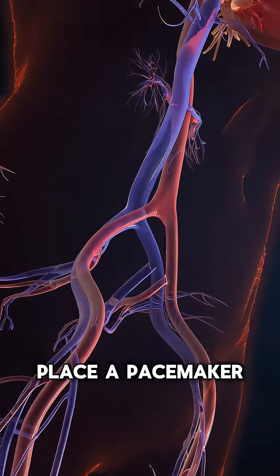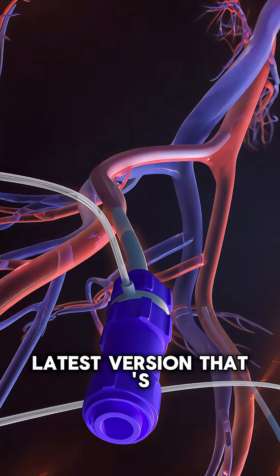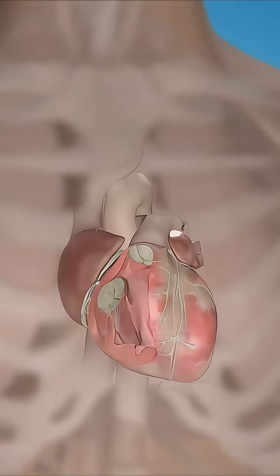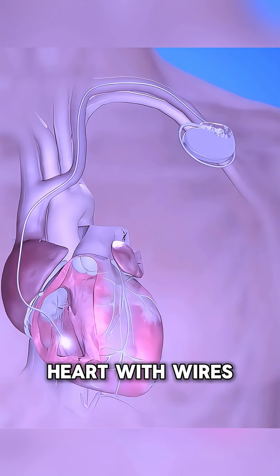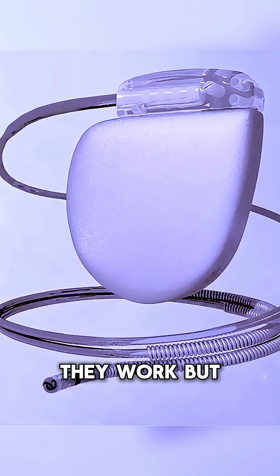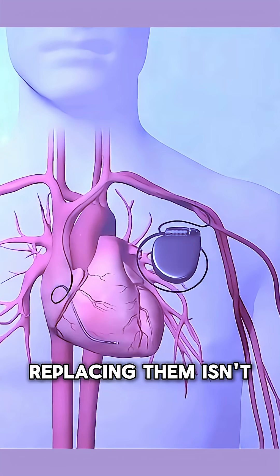Did you know how doctors place a pacemaker to regulate your heartbeat? Let's break it down and see the latest version that's changing everything. For decades, pacemakers have been implanted under the skin of the chest, connected to the heart with wires. They work, but those wires can break, cause infections, and replacing them isn't fun.